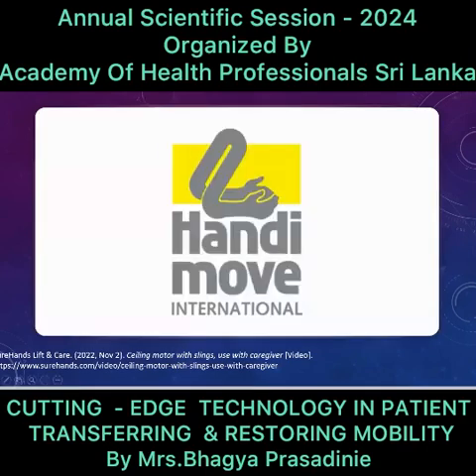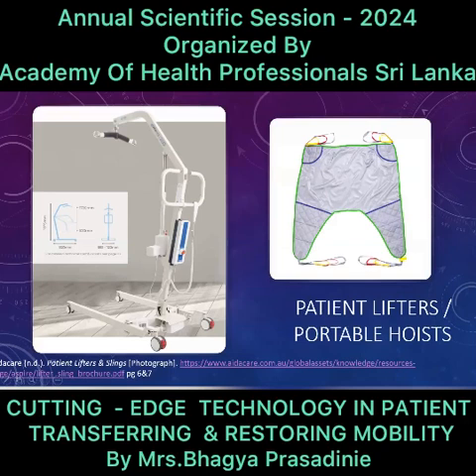So next we are moving on to the portable hoist. This portable hoist is doing the same mechanism as the ceiling hoist, but the difference is this portable hoist does not need to be placed in one place. It is very mobile. You can take it anywhere you want, so that the patient can be transferred from the bedroom to the living room or wherever it is. You can just transfer the patient on even surfaces. So we can use the same sling as the ceiling hoist for this.